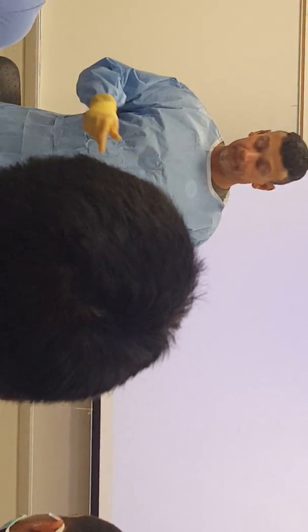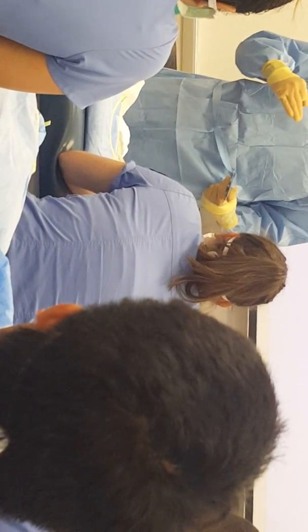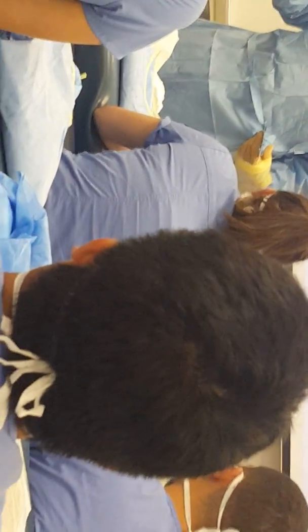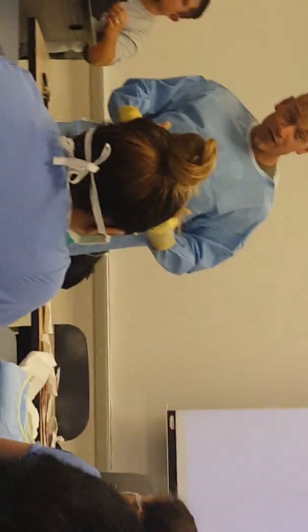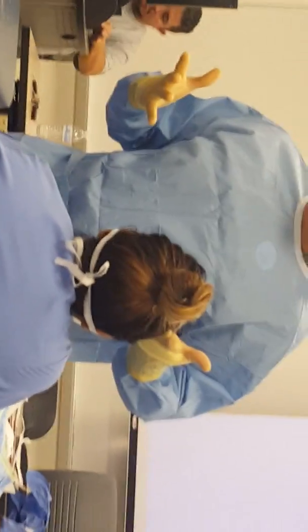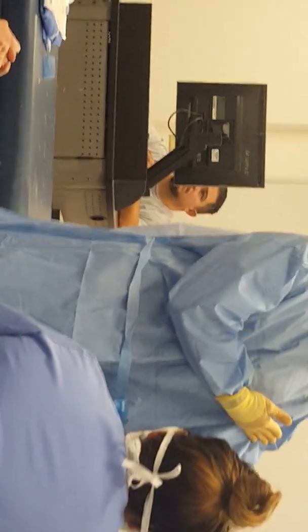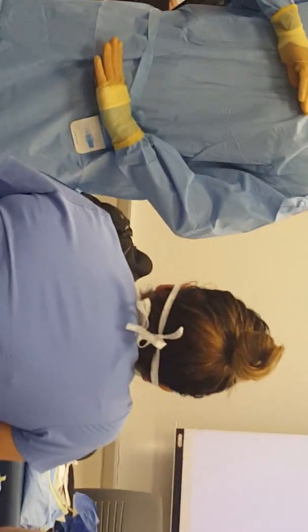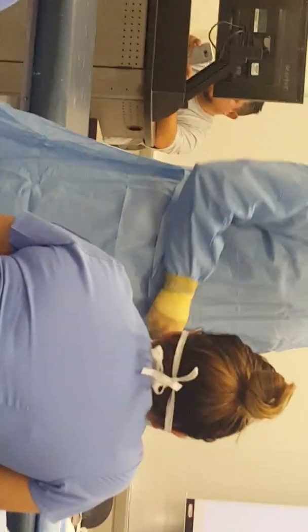Now, am I done? No. I got this part. And you guys drive me nuts. I really cannot stand it. After 20 years of watching you guys do this, it really, I don't know. You guys make me drink, I swear. So, this is what you guys like to do. And what's funny is I show you what you're going to do and what I don't like, and you do it anyhow. So you come up to me and you go, why do you do that? What did it say in the video? I'm sterile, right? Now that my gloves are on, I'm sterile from here to here. I can touch this. Touch the damn thing. So then you get cocky, and you go, oh yeah, I can touch it.